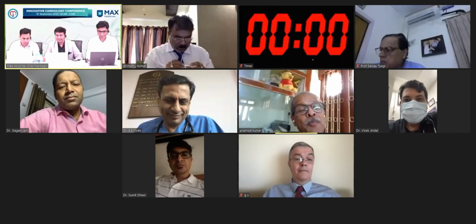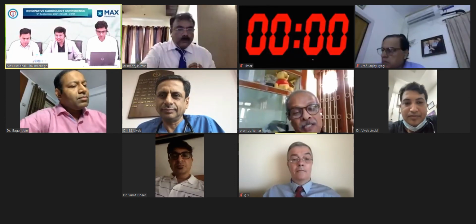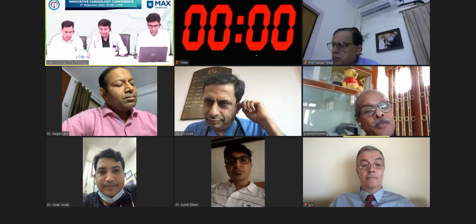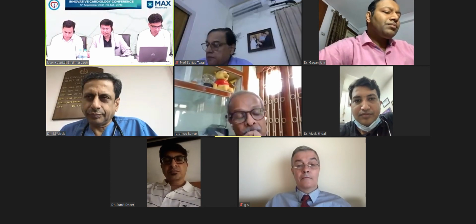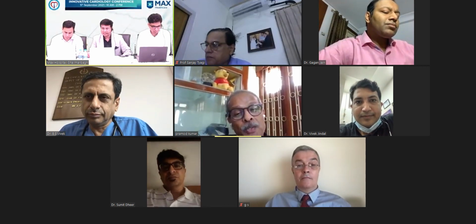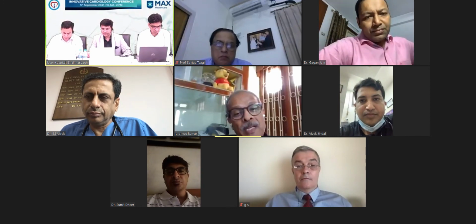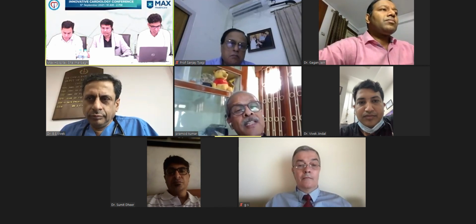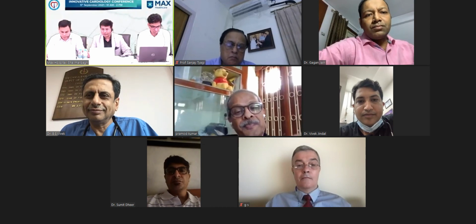is actually very important. We always thought that they are all competing with each other, the rota and the IVL, but here is a very good example where you have seen that they are complementary to each other. And as Dr. Devendra and Dr. Parida explained very well, the intraluminal can be taken care of by the rota, but the one which is in the media or in the adventitia or deep can't be taken care of by the rota. So beautiful example of the combination of the two techniques, and excellent result as expected from Dr. Naveen and his team. Thank you very much, sir.